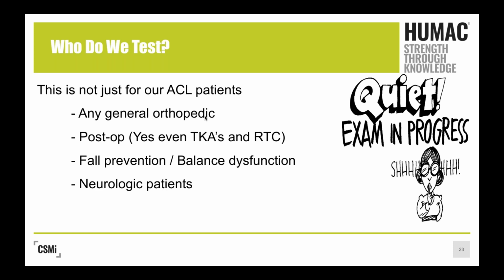Also, it's a good baseline and progression measurement. So you don't have to be as particular with what metrics they're meeting before they can be discharged from that.